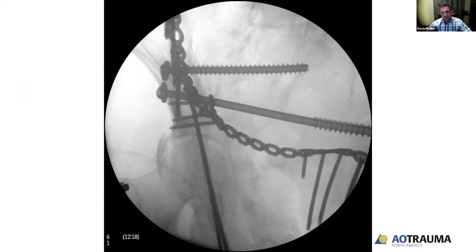And going back to what I mentioned earlier about not boxing yourself out for future fixation, I did not think that this was enough fixation for the sacral fracture, and basically intraoperatively felt that I was probably going to need to have one of my spine colleagues back this up with lumbopelvic fixation. So I think it's important to get this view, this obturator outlet view, to make sure you do have a pathway for an iliac bolt, despite all of your hardware, because those bolts are rather large, and if you have screws that go down the central aspect of this pathway, then it makes it very hard to place an iliac bolt on the right side of the hemipelvis. So I think it's important to get this view.